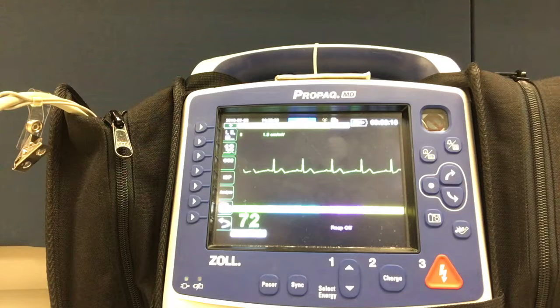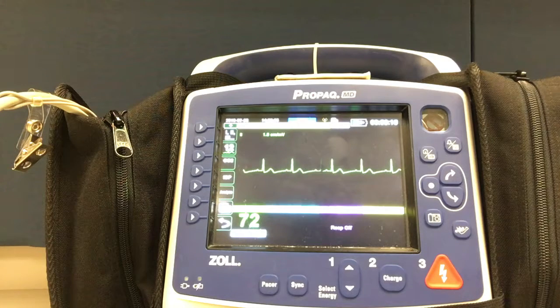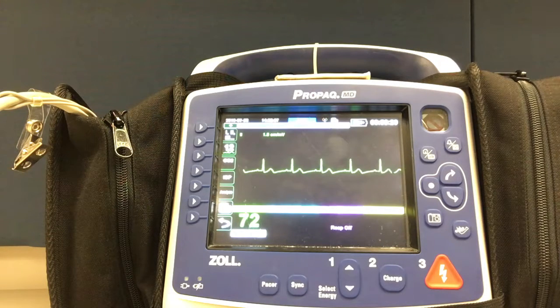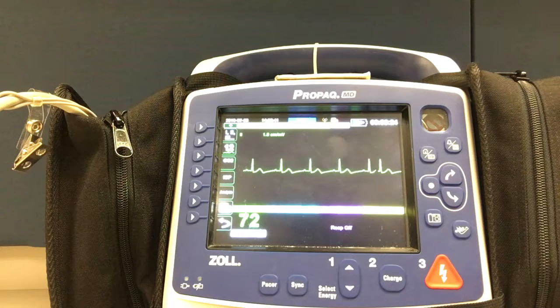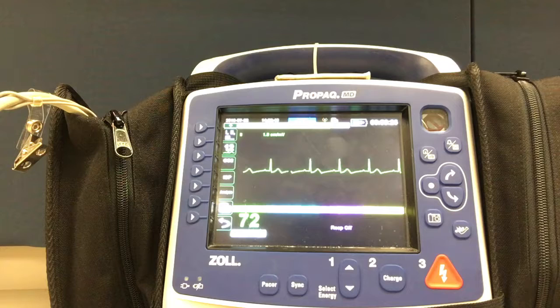One lead goes on each limb, creating four limb leads. There are six precordial leads, also referred to as V-leads, creating V1 through V6.